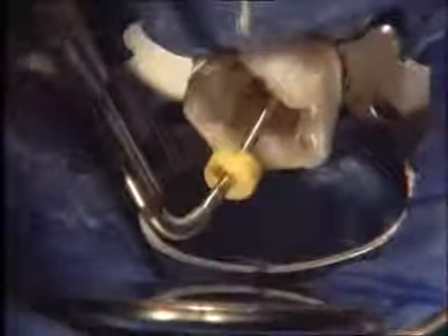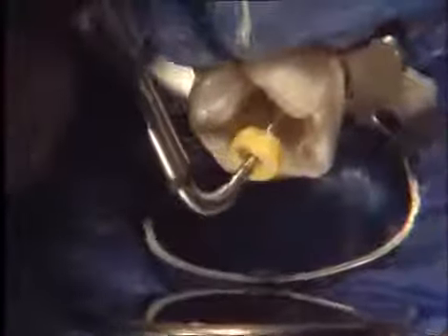After the melting of the cone with the tip of the Buchanan plugger in the pulp cavity area, the activated plugger is driven through the gutta-percha in a single motion to a point about 3 millimeters shy of its apical binding point. While maintaining apical pressure on the plugger, the button is released, and the plugger slows its apical movement as the plugger tip cools. After the plugger stops, about 1 millimeter from its binding point, apical pressure is sustained until the apical mass sets, about 10 seconds, taking up any shrinkage that occurs upon cooling.